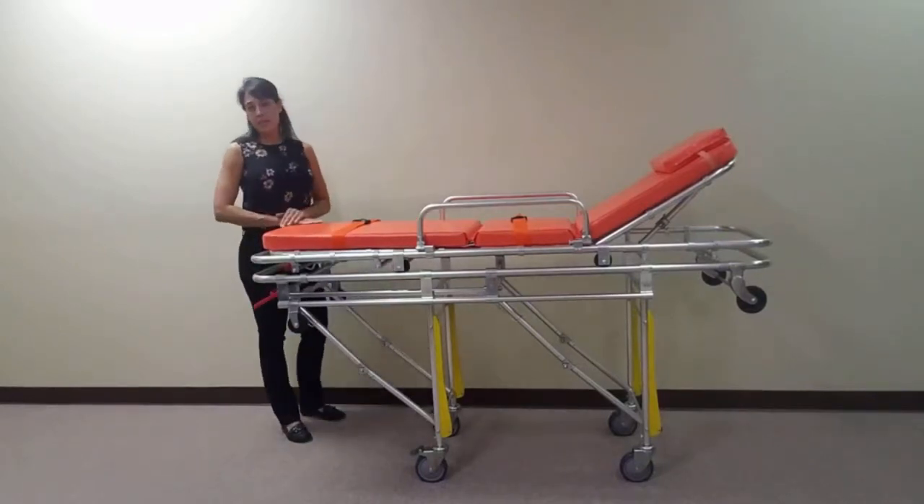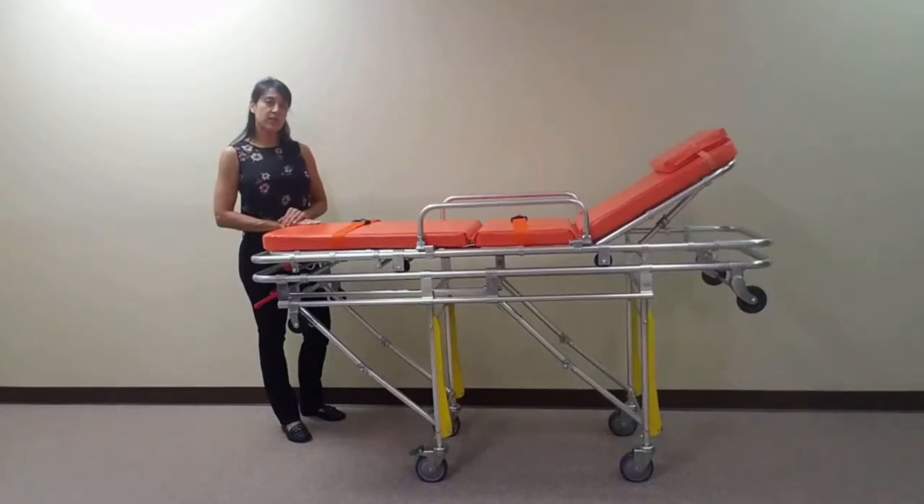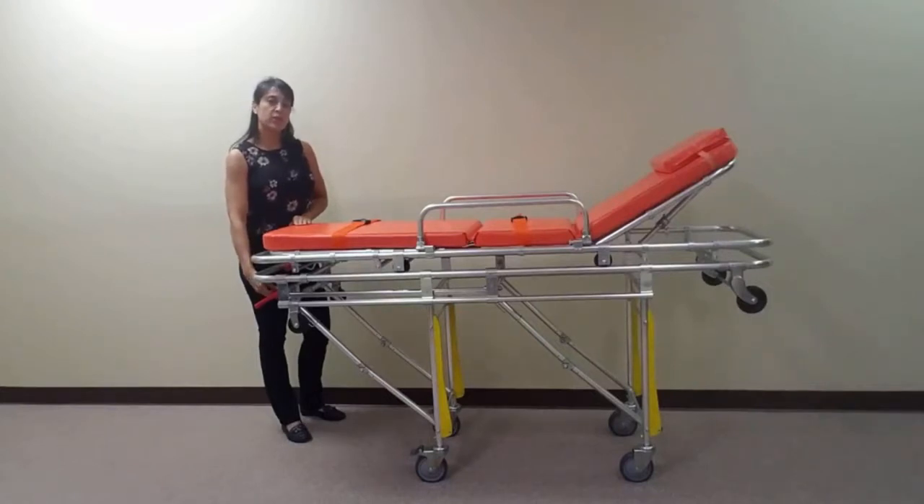To avoid accidental collapse, this stretcher is equipped with a locking lever located at the foot end of the stretcher. Simply turn the lever down or perpendicular to lock, and up or horizontal to unlock.